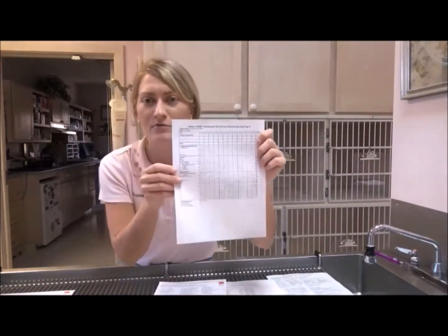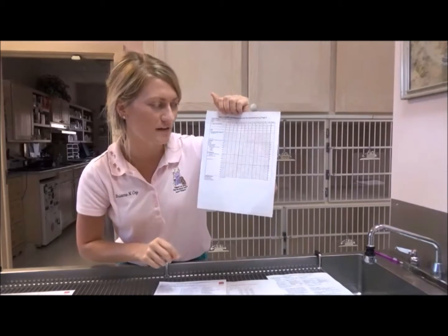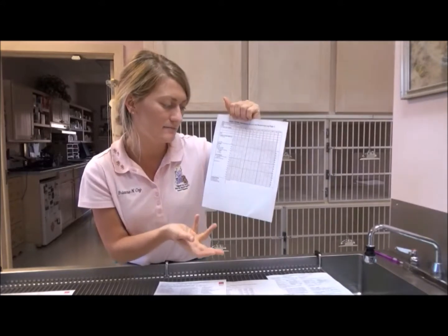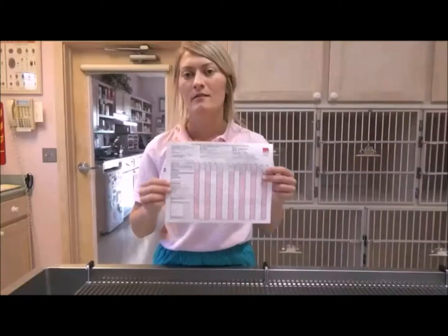Next, we have our actual monitoring log, which we use throughout the anesthetic procedure. We chart things out by hand every 5 minutes, and we'll document their temperature, pulse, heart rate, respirations, diastolic, systolic, mean arterial pressure, pulse ox, and end-tidal CO2.